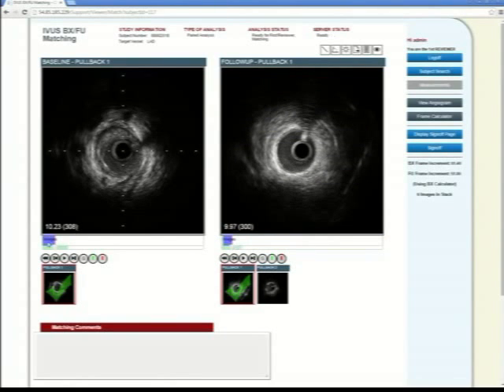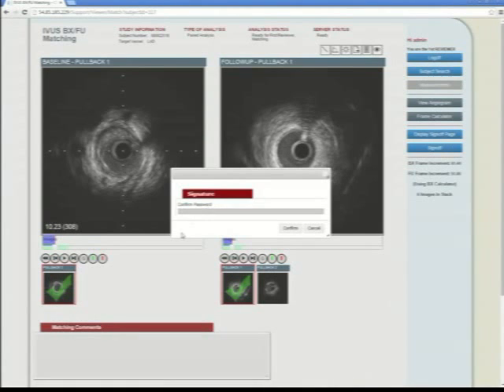So it would in practice be much longer than this. It would be more like 50 to 100 millimeters, like almost this whole thing. But for demonstration purposes, let's... Okay, so you've just matched the anatomy. I've just matched the anatomy, and so I'll type in your password.